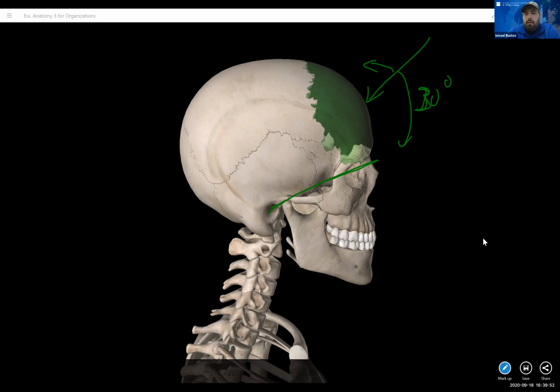If I move my CR, oh, hold on. I hit the wrong button there. All right, let me move this out of the way. So again, if I move the CR this way, this thing's going crazy. So I move the CR this way. Now I've increased my angle, and it's going to be more than 30 degrees.